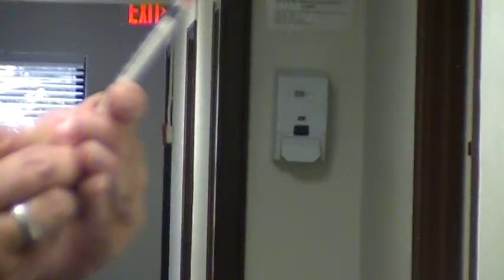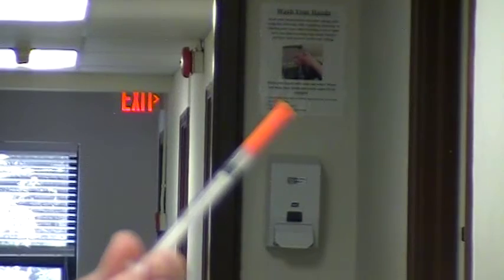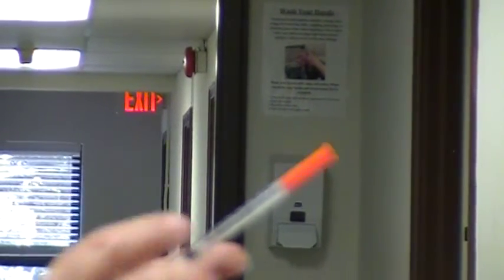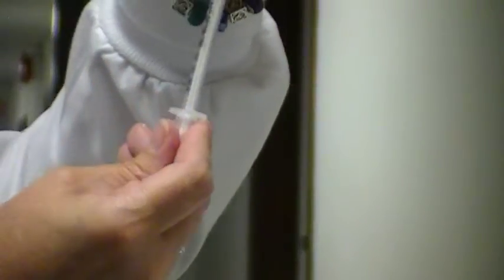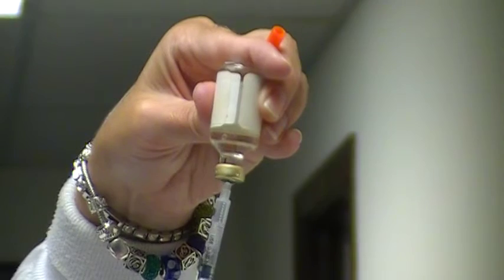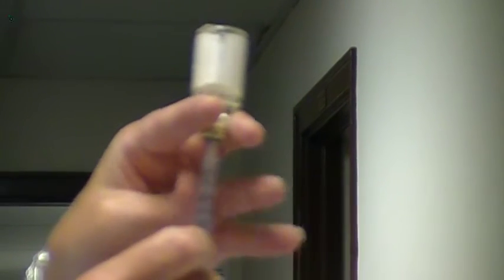I'm going to clean my vial with my alcohol prep for about five seconds. Any time I draw from a vial, I have to put in whatever amount of medication I'm going to take out — I have to inject that appropriate amount of air. I'm giving 80 units, so I've got my insulin syringe, I'll pull it up to 80 units of air, take off the cap, inject the air, then pull out my 80 units of insulin, getting rid of all the air bubbles, and making sure I have the exact dose — 80 units.